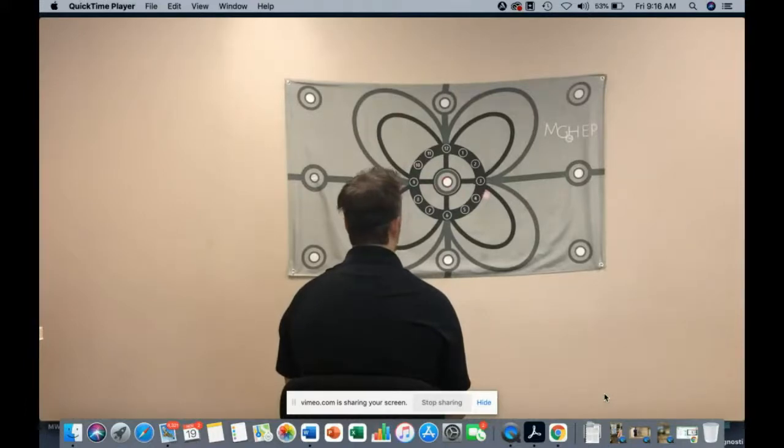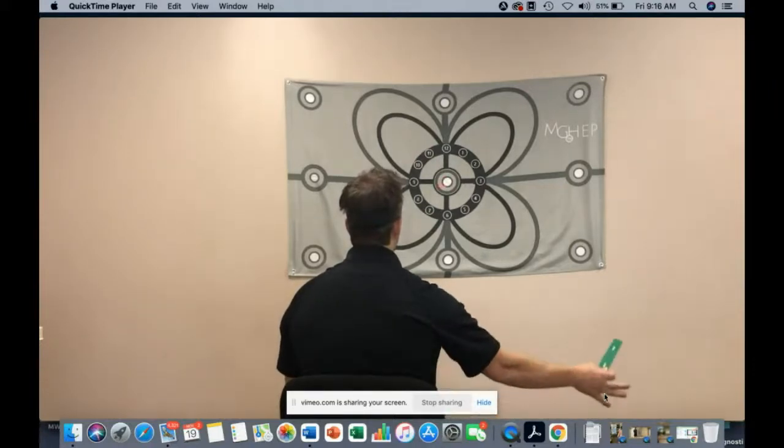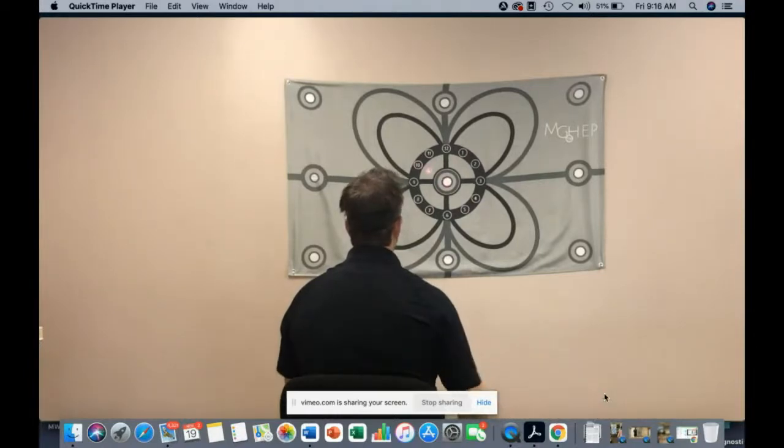And of course you can do some simple math drills with this, okay? Or give 3 numbers, go 2, 9, 6, go to the second number, and they have to go to the 9. So breaking down some cognitive overlays there for function and problem solving, and trying to get away from some initiation there can be beneficial.